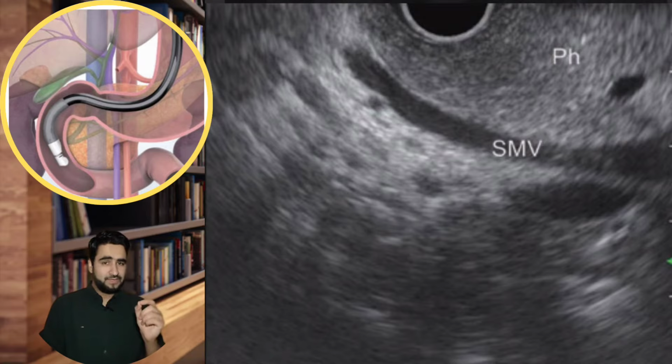Now carefully observe the head of pancreas, which can be visualized between the superior mesenteric vein and the shaft portion of transducer. To make sure you don't miss the inferior head of the pancreas, try to follow the superior mesenteric vein towards the inferior side, that is left side of your image.